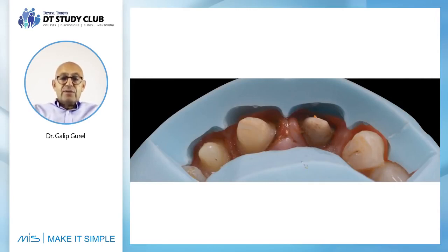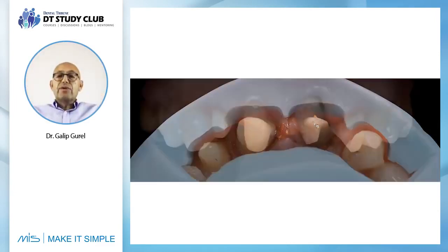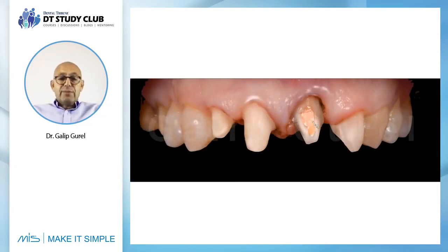And this is what I did prosthetically, just remove it out, so that pretend as if this tooth is in the same buccal position, but my prep was not limited to the actual gingival margin. It was way in, at least like 5-6 millimeters way in, where the tissue was loose anyways, to see if the tissue will collapse and come more coronal. And this is what I'm doing. Probably I'm prepping this teeth all the way up to here from under the soft tissue.